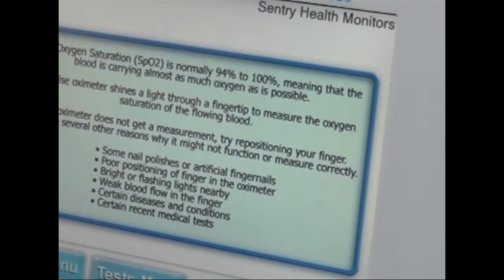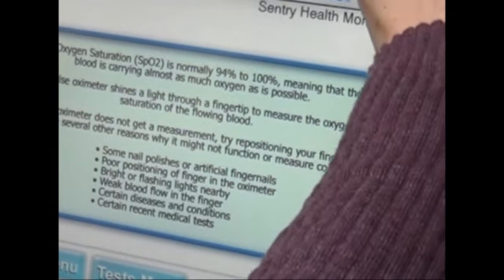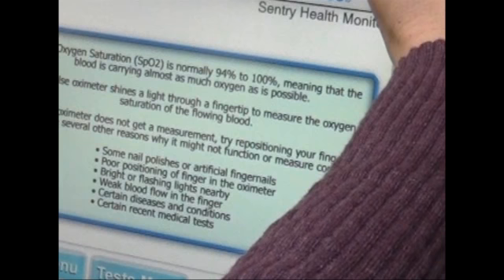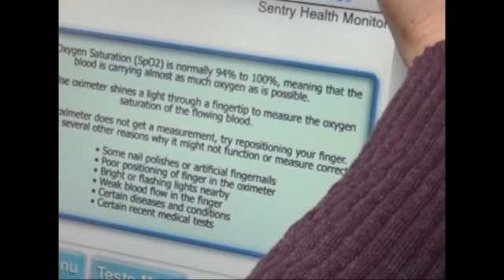And just keep that in mind. Again, it's a measurement device. You should always encourage them to go to their doctors to check and make sure if there are other issues once you get your results.